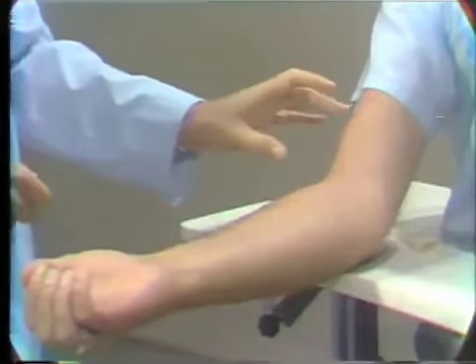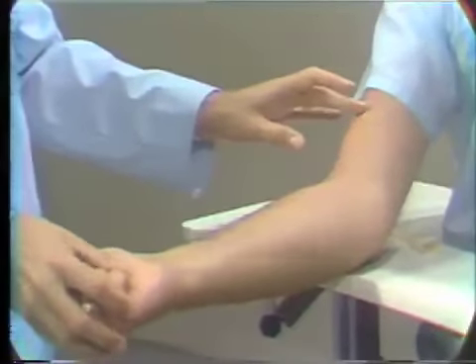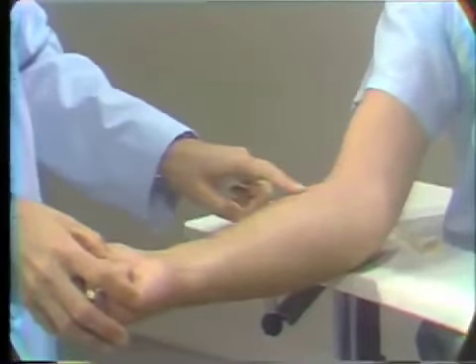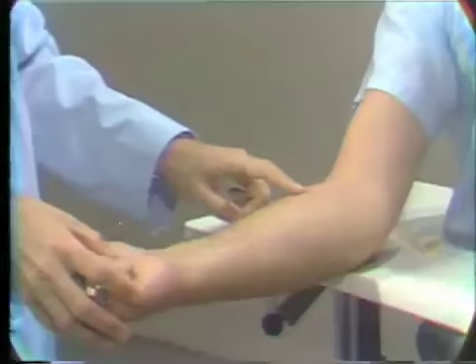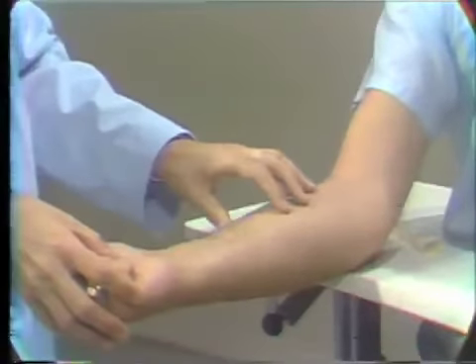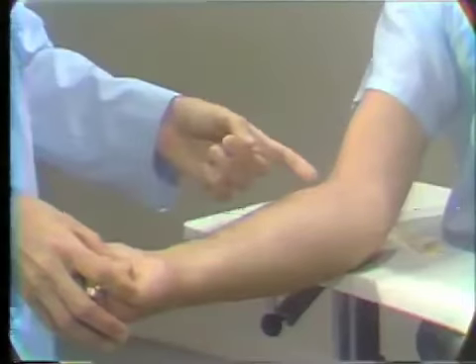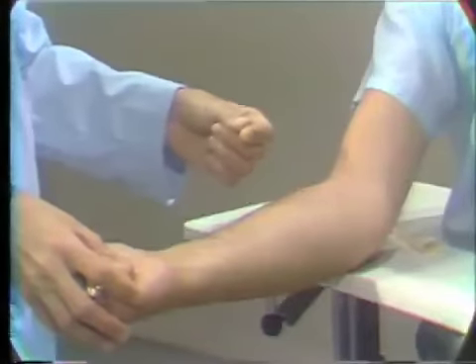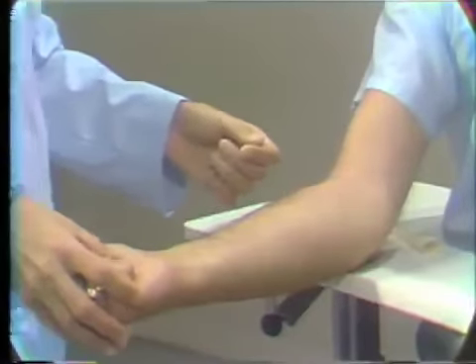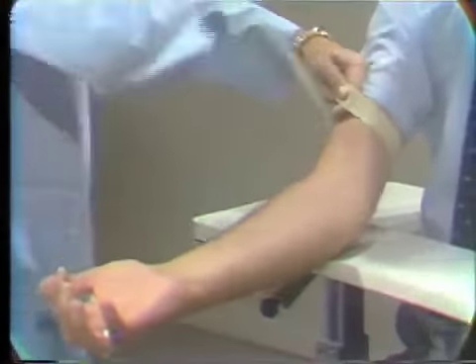Once you place the tourniquet, do not delay too long. You will have your patient make a tight fist, but if you delay too long, you will congest the arm, which will interfere with the red blood cell count, the hemoglobin, and the hematocrit by getting congestion in the arm. So for hematologic studies, we must make this puncture quick, and we must be as accurate as possible. Now again, placing the tourniquet, the finger next to the patient, as tight as possible.